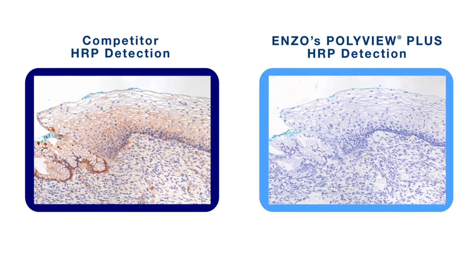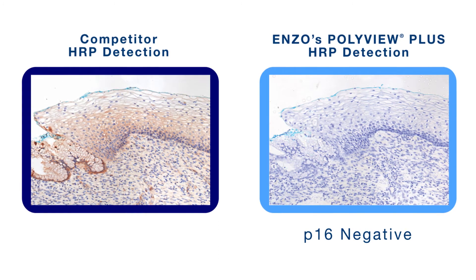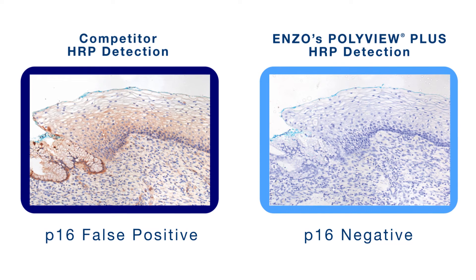As expected, tissue stained with PolyView Plus HRP detection system is negative for P16, while the competitor's detection system gave a false positive result.